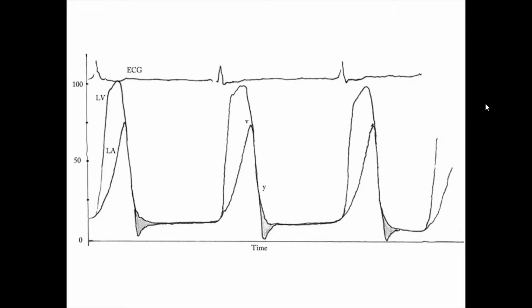So most likely it is mitral regurgitation. Yes, this is most likely isolated severe MR and atrial fibrillation. What about LVEDP? Here around 25, maybe around 10 to 15.